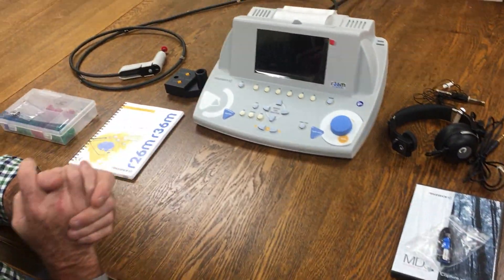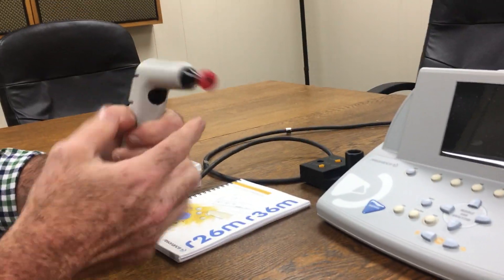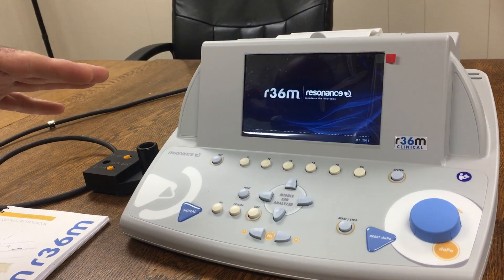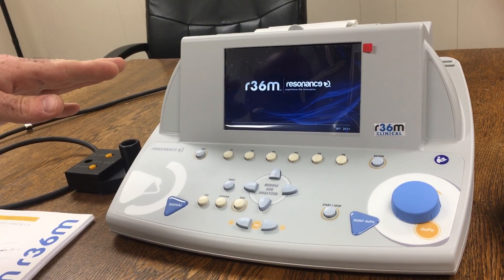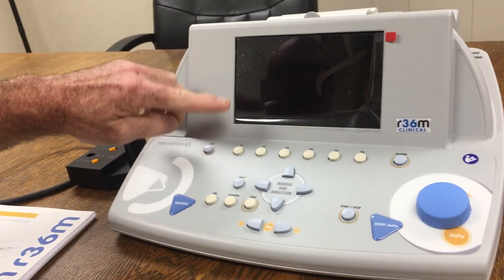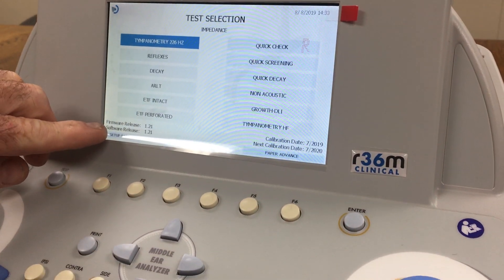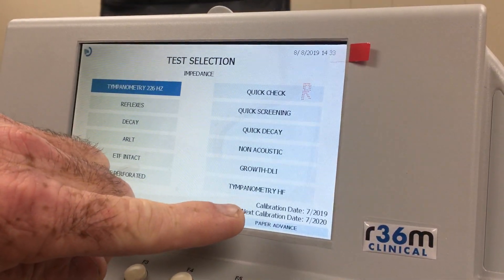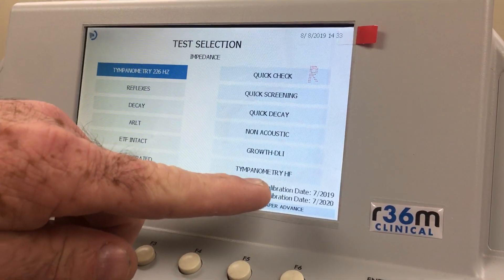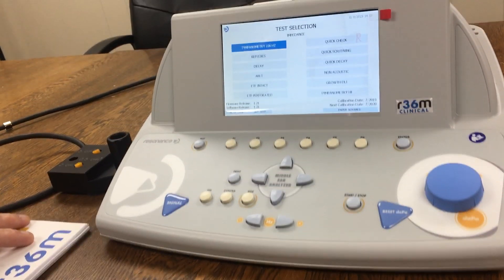We're going to jump right into it. I've already attached the probe and the tip, so we'll go ahead and turn it on. When you first turn it on, you'll hear it loading up and then you'll get your test screen. This tells you all the test selections. Down below it shows your firmware, your software, your calibration date, and when your next calibration date is. When you first buy one, it will always come calibrated with one year from the time it was sent to you.